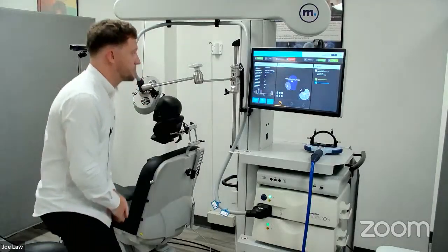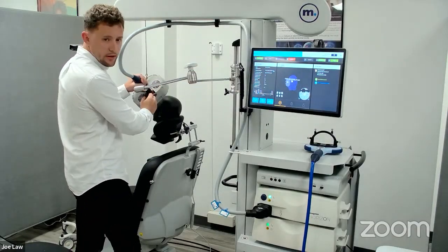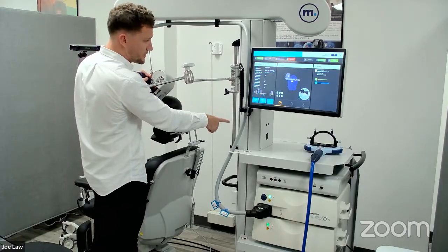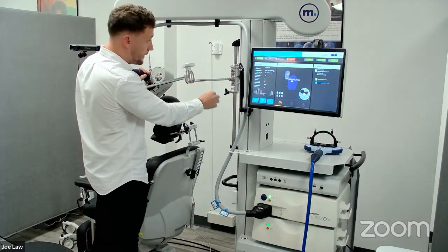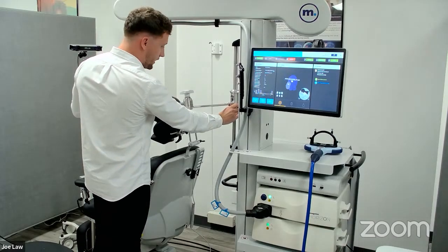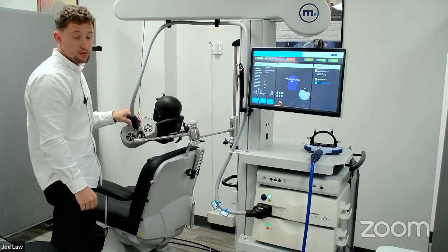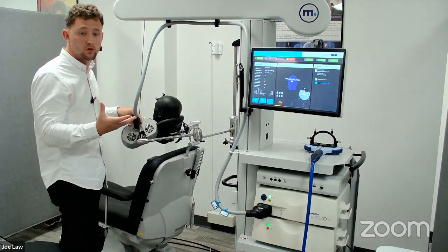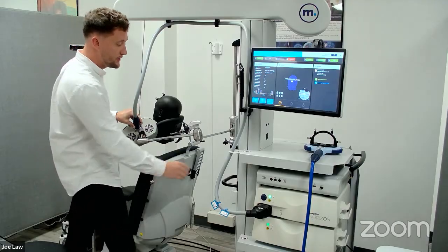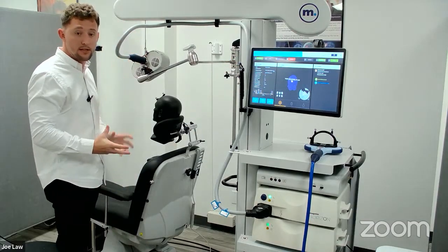Great question. Yep. So the arm is fully adjustable. If you unlock the coil, you'll notice, and I hope you can see this okay, there's a boom that's upright on the system. You can unlock this boom, and you can take the coil all the way down here as low as you want, for your even shorter patients or shorter technicians or treaters. And then obviously for your taller ones, you can bring it all the way up here. So there is an adjustment there.